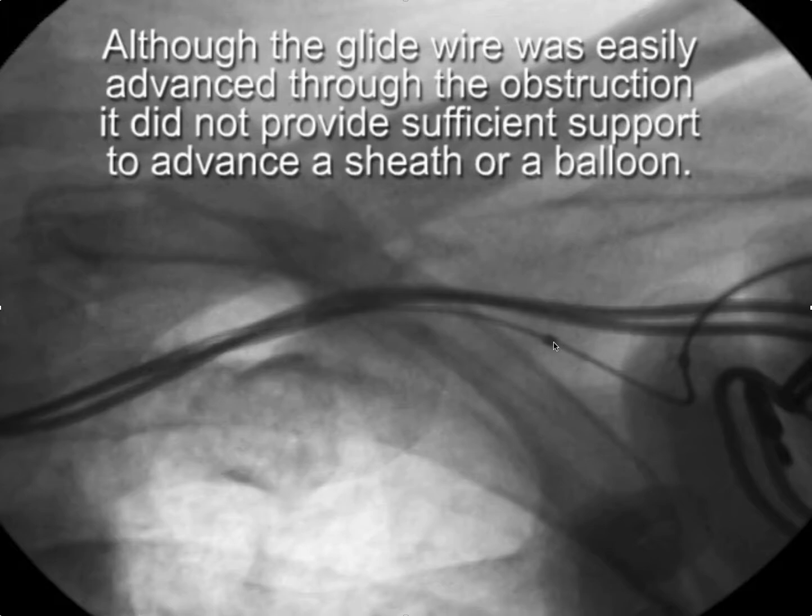In this case, you can see we're trying to advance a balloon. Here's the tip of the balloon, and it's buckled back as we try to advance the balloon through the occlusion, which is here. So what do you do under these circumstances? There's actually a fairly standard sequence of steps that you can take to deal with this.